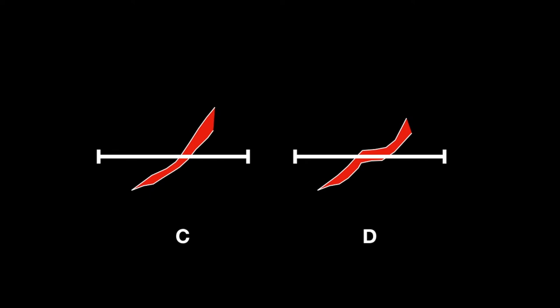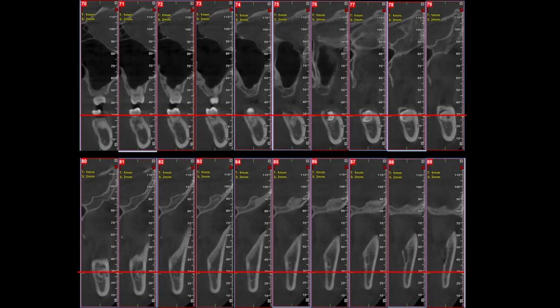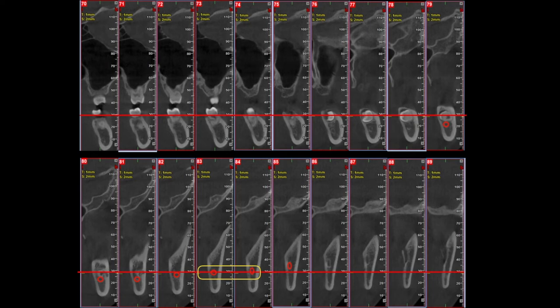So how this is exposed on the horizontal level depends on how steep the angle is as it rises in the ramus. If the nerve is ascending at a steep angle, then most likely it will leave a small footprint at the level we are trying to reproduce, like it is presented in option C. If, however, the canal is not ascending for some part and stretches parallel to the horizontal level for some millimetres, we could see a projection as in image D. Going back to the vertical slices, let's try to identify the position of the nerve in relation to the level we want to reproduce. Let's trace the nerve in slice 79, where you can see it is significantly lower than the level we are aiming for. It is only crossing the red line for slices 83 and 84 before it moves higher. That means the nerve is ascending rather steeply, crossing the red line for less than three vertical slices, leaving a footprint which should be no more than four to five millimetres long.